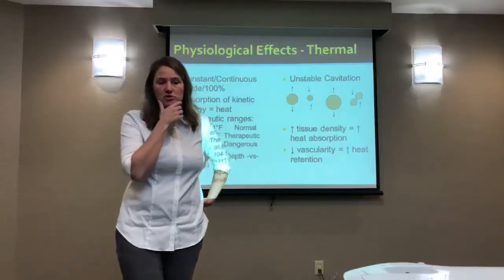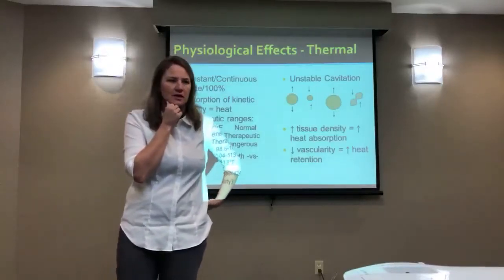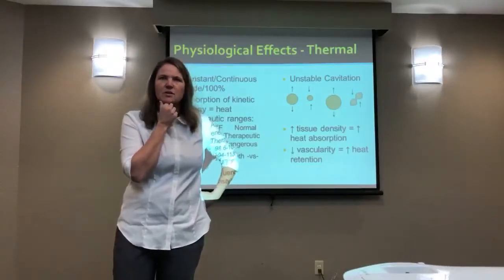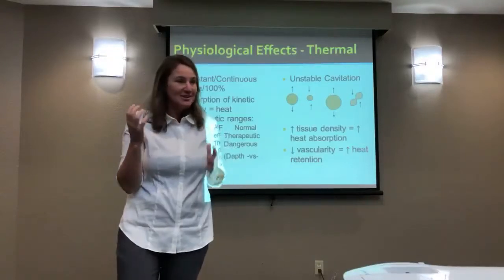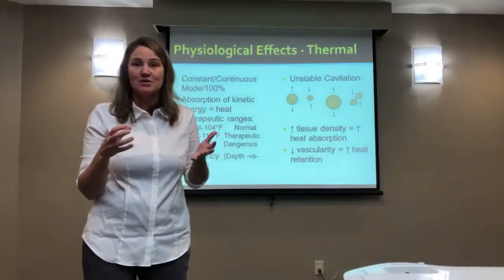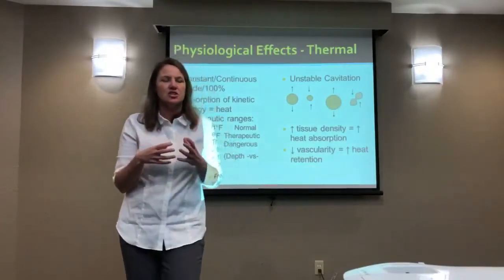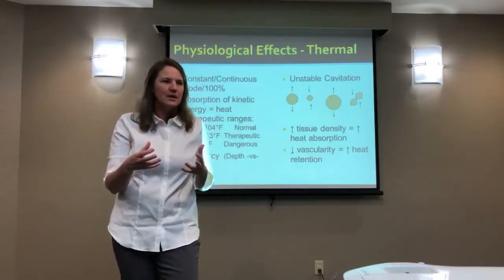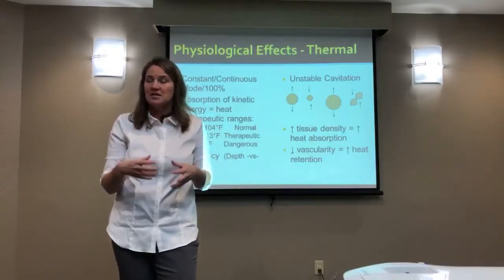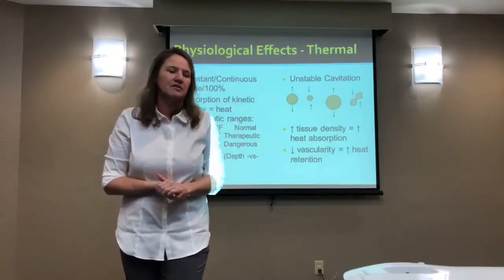So basically this cavitation is credited for some of the benefit. Now when I was first learning ultrasound, I remember as a student the word cavitation scared me because I thought, if I create a bubble in their blood vessel, could I not hurt them? Could that not injure them? The fear was there that I was going to cause some harm. That's not the case though. If you're ultrasounding, the cavitation that's created in the liquid environment is not a big enough bubble to cause any harm. So that fear that I had was unfounded. There was no reason for me to be afraid of it.